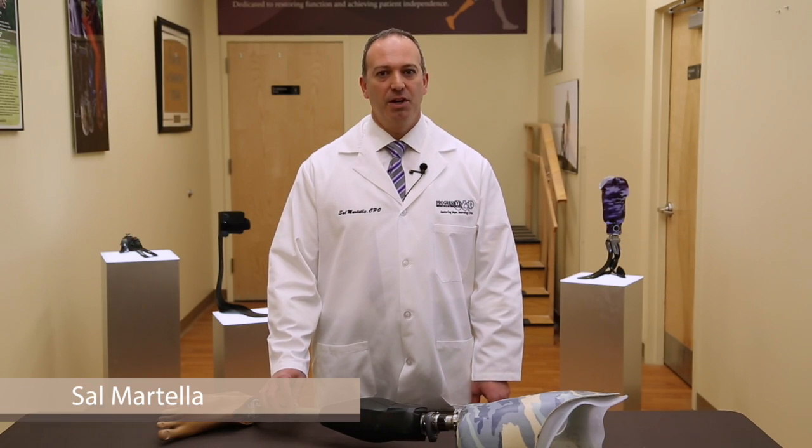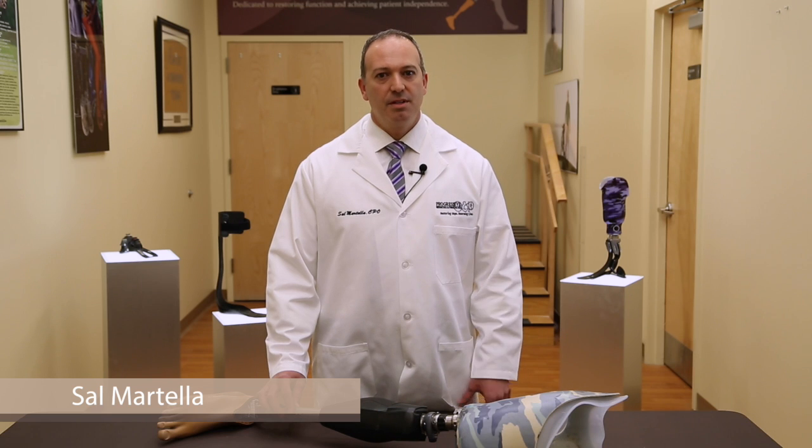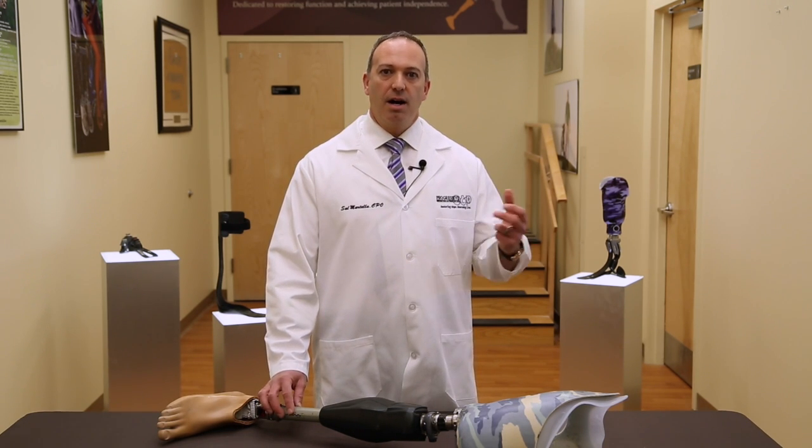Hi, I'm Sal Martella, CPO and co-owner of Progressive OMP located in Albertson, New York. Today I'll be talking to you about the Genium, which is fabricated by Ottobock.